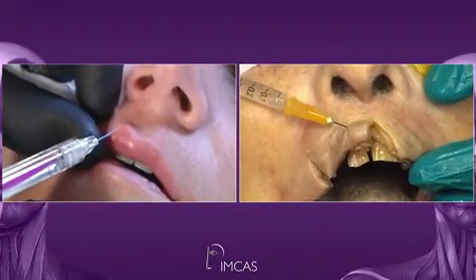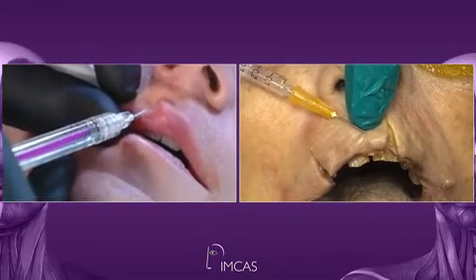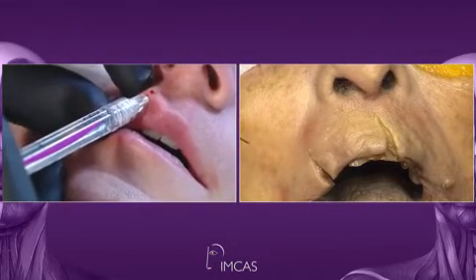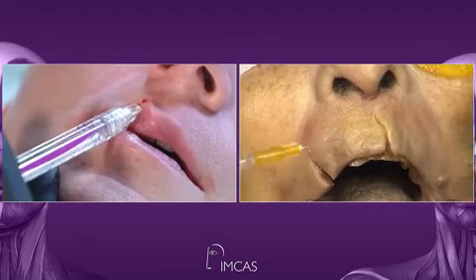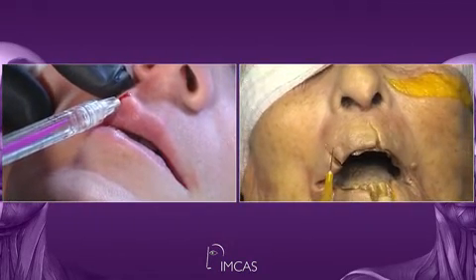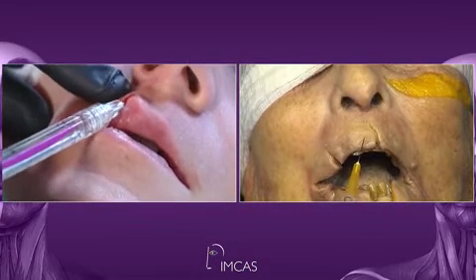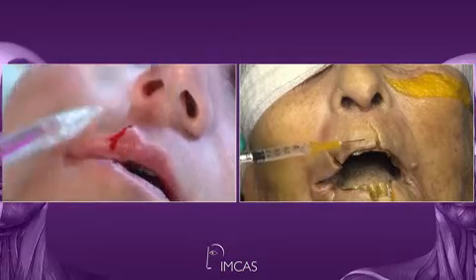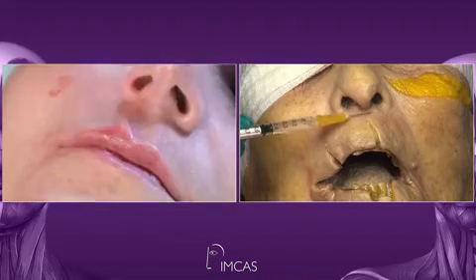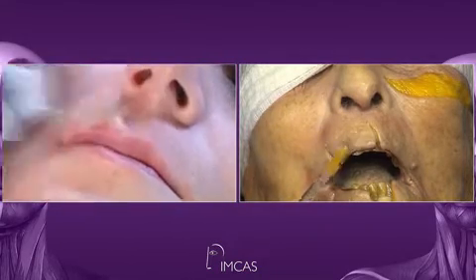So it's a small volume injection, constantly looking both for blanching and bluish reticulation, which would mean an intravascular venous injection. Sebastian, just remind us what we have to be careful of in this area while injecting a sharp needle, the philtrum. The danger here in the philtrum is that the superior labial artery runs to the midline and in a lot of cases runs very superficially in the subcutaneous planes, and then gives off, in general, two branches that run parallel towards the base of the nose. Therefore, we have to be very careful not to perforate or injure these arteries.